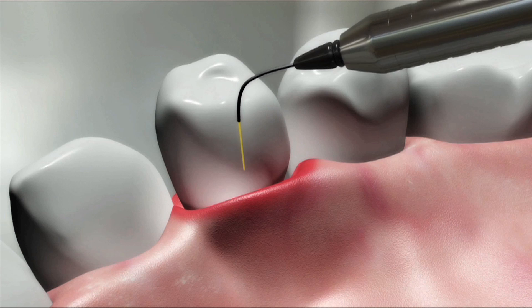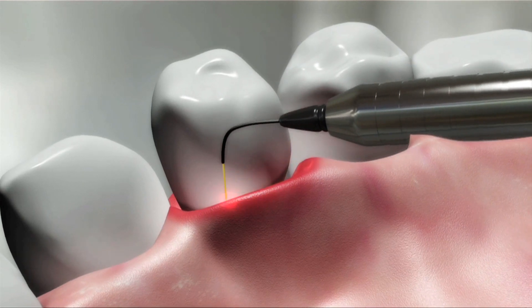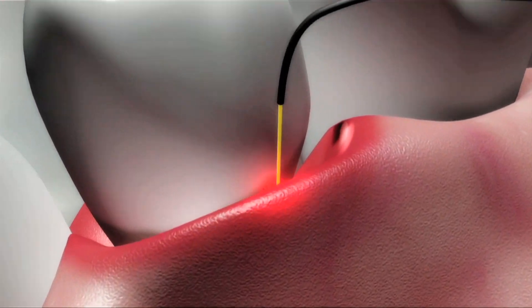After completing a gross debridement of the treatment area, the ND YAG laser is used to remove the diseased epithelial lining to within one millimeter of the bottom of the pocket.